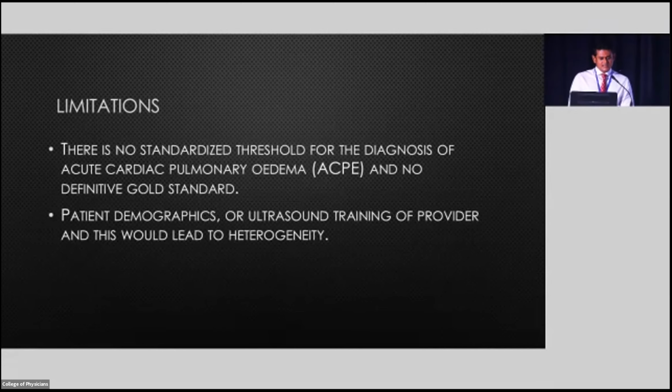But the limitation: there is no standardized threshold for diagnosis. How many B-lines do you need to say that this patient has pulmonary edema? So you know fluid B-lines or confluent B-lines, you know there's fluid. Also patient demographics or ultrasound training of the provider would lead to heterogeneity.